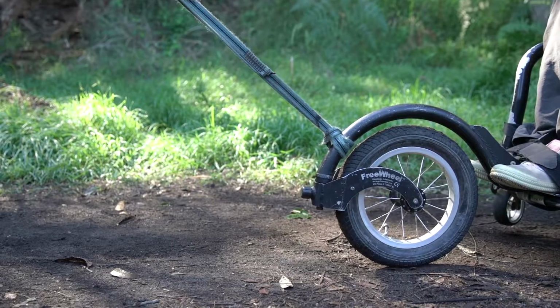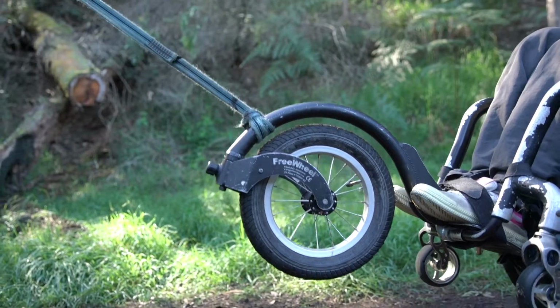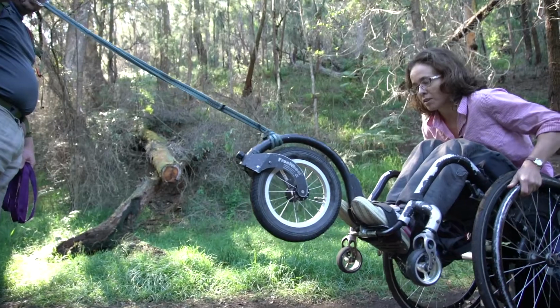For a shorter husky tape setup, the advantage of that is that it's really social and can mean that you can communicate really clearly with your team as to what's going on. The disadvantage of a shorter setup is, of course, that as you get onto steeper terrain, the front of the freewheel will start lifting, and that can lead to the chair misbalancing or even tipping over backwards. So there's some pros and cons there of a shorter setup.